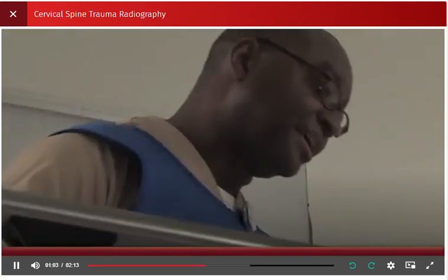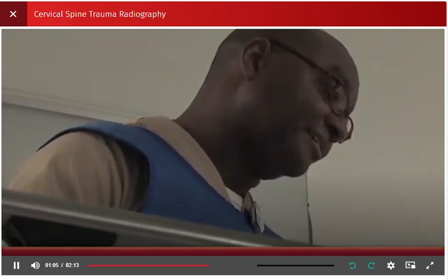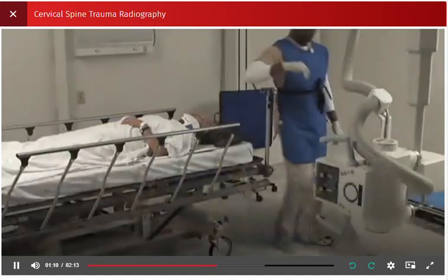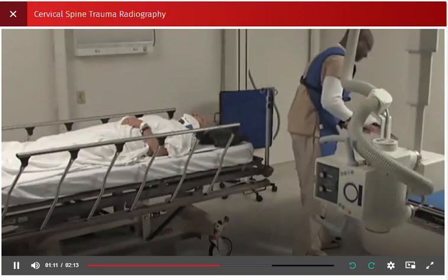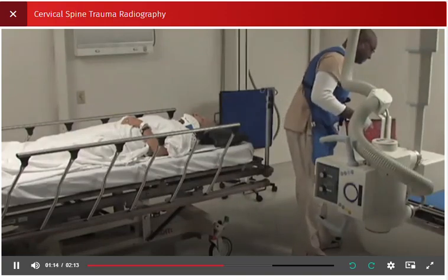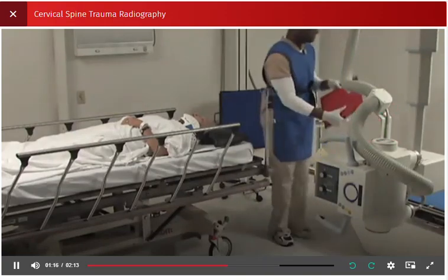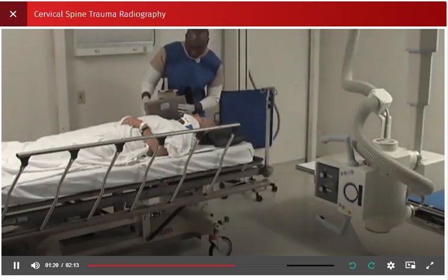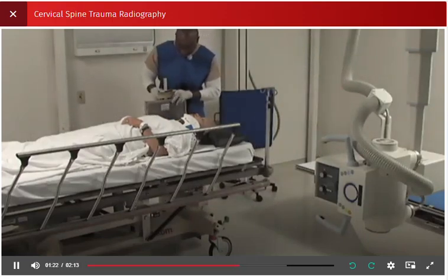If the patient is conscious, inform the patient of what will take place and the protocol of a cross-table lateral cervical spine. Obtain the appropriate size image receptor and grid. Place the image receptor and grid in a cassette holder and place it crosswise so that the long axis of the image receptor lines up with the cervical spine.